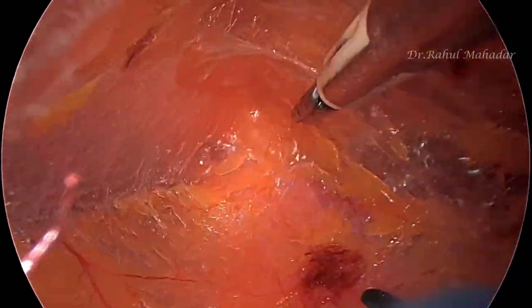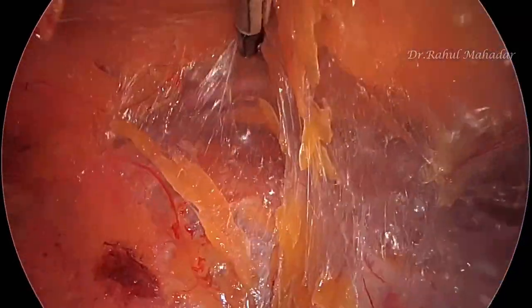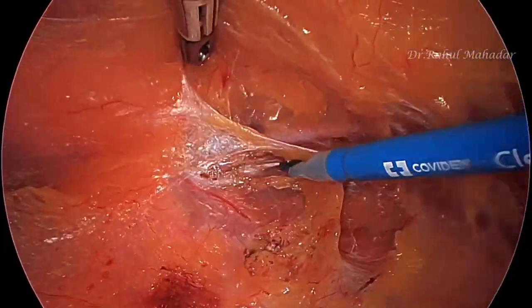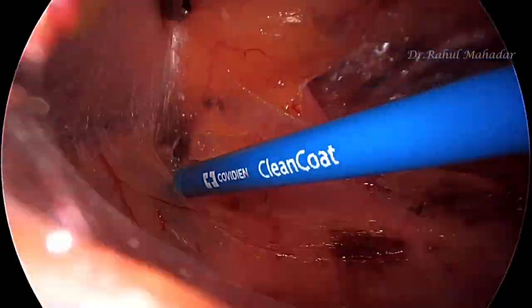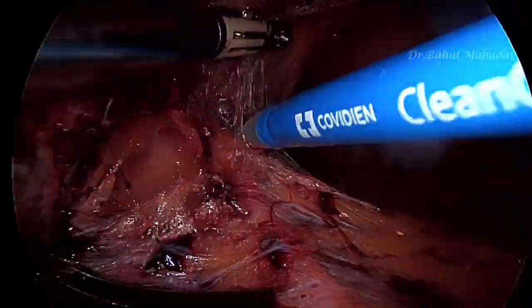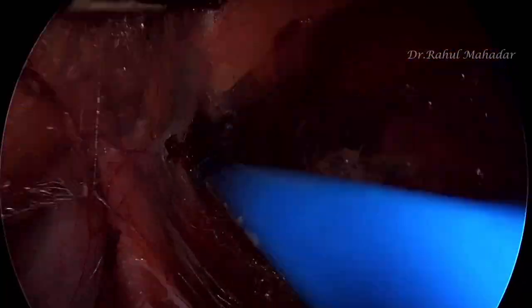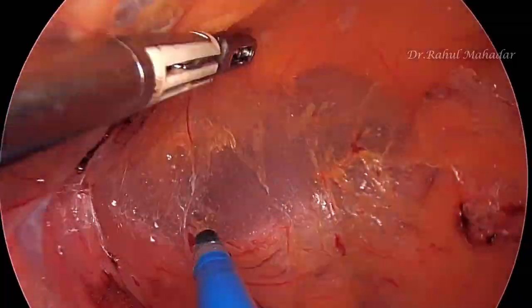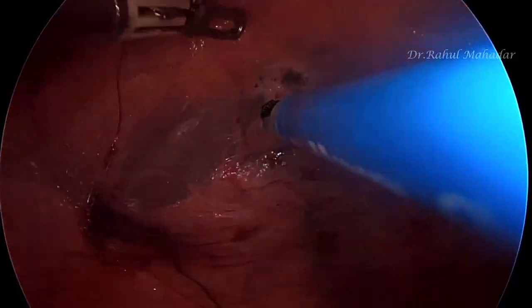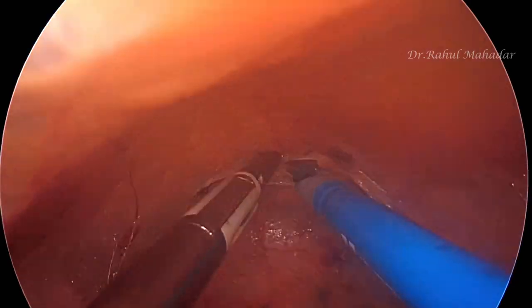This patient had a left side large direct hernia which was irreducible, and on the right side, as compared to left, it was a smaller hernia but quite large as well. There was also a lipoma of the cord on the left side, which has been removed while doing the dissection.